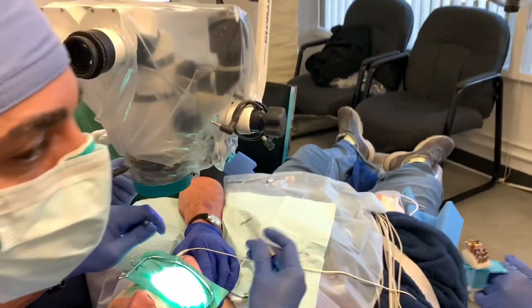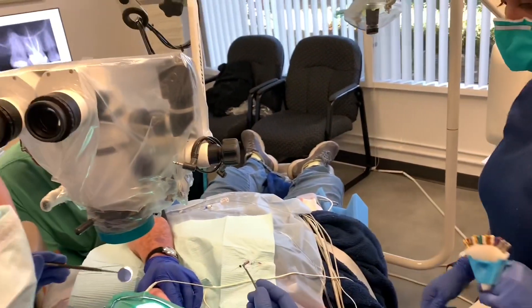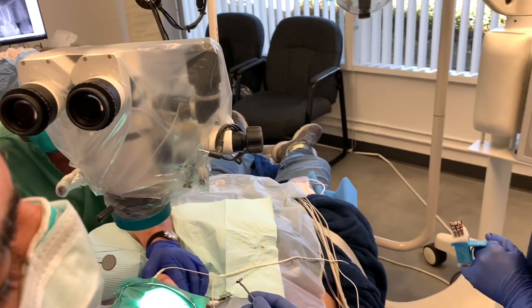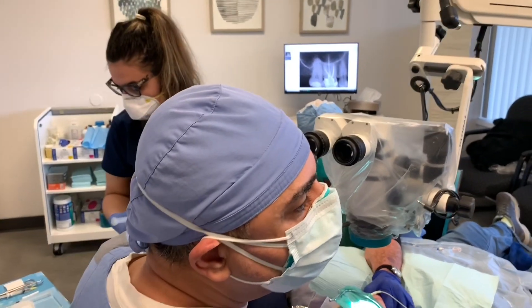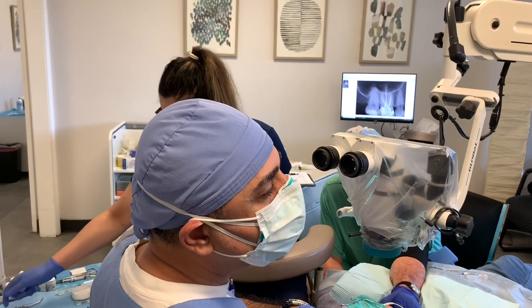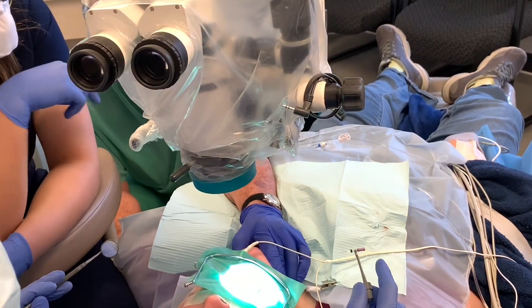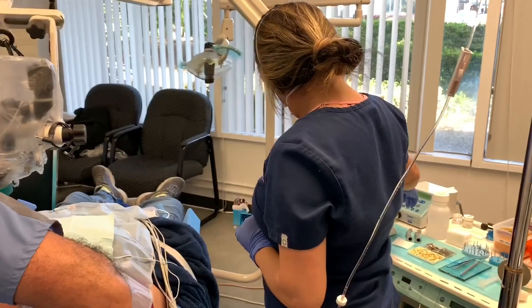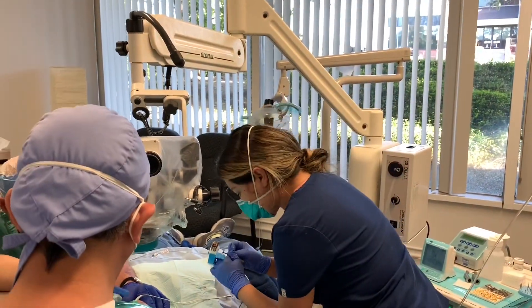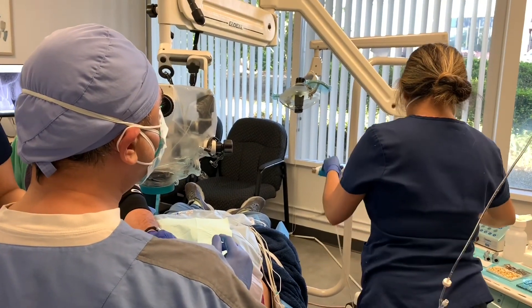Now I determine my working length with my apex locator. It reads 21.5mm, but since I tend to be a little heavy-handed, I subtract half a millimeter — so I go with 21mm. Mesiobuccal is 21.5, distobuccal is 22.5, and palatal is 22 to 23. So we'll do 21, 22, and 23.